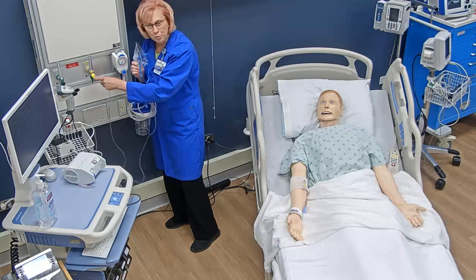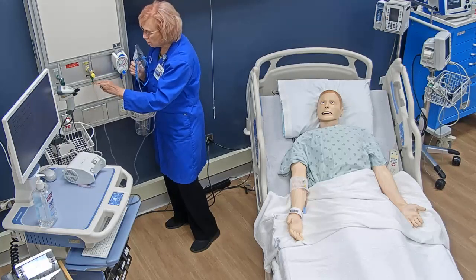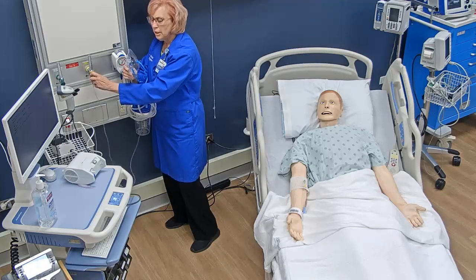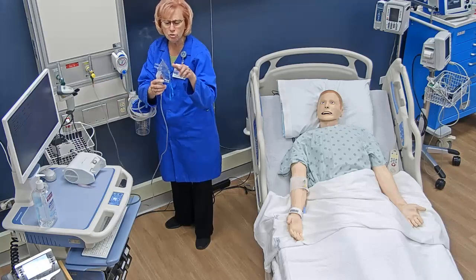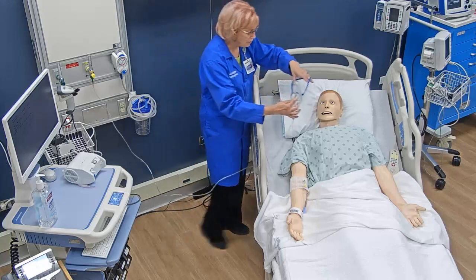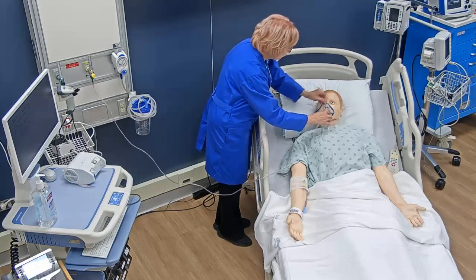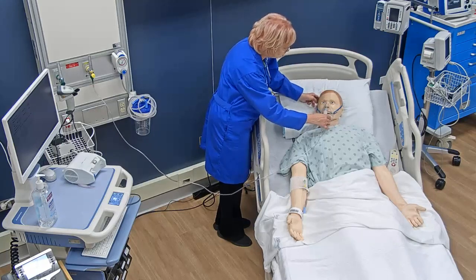Here in Harper Hospital, we use the medical air to simulate oxygen. So I would hook up my tubing here, and I would turn my flow meter up until I see that mist. I don't know if you can see the mist on the camera or not. I can see it, so I know my medicine is ready to be delivered. I put the mask on my patient, making sure it's covering his nose and the mask is under his chin.